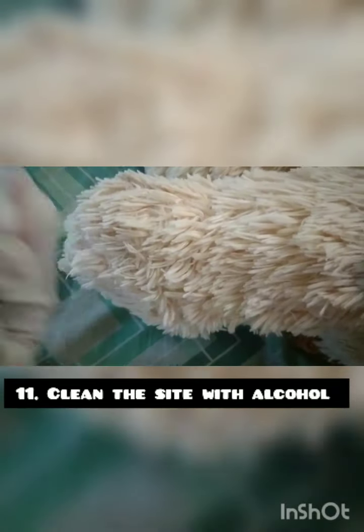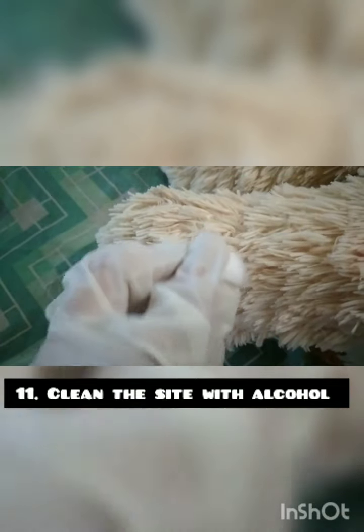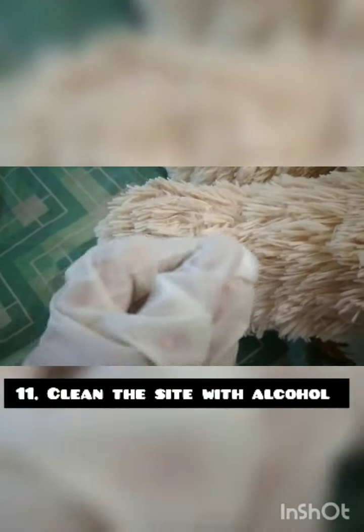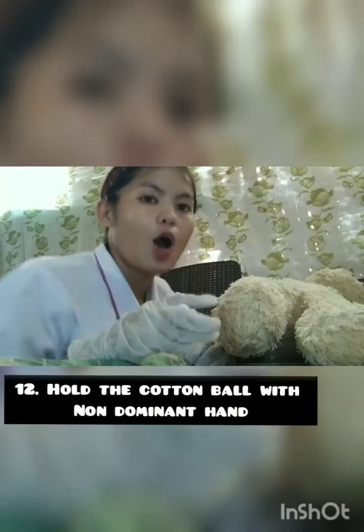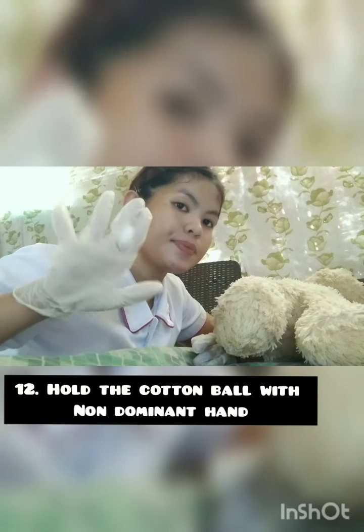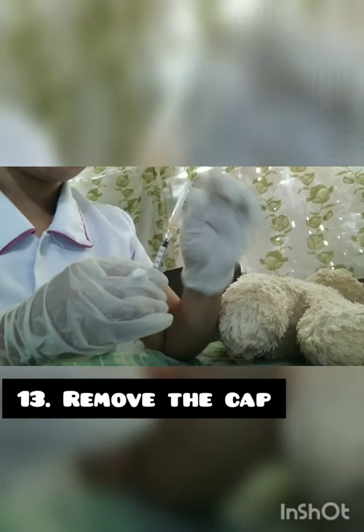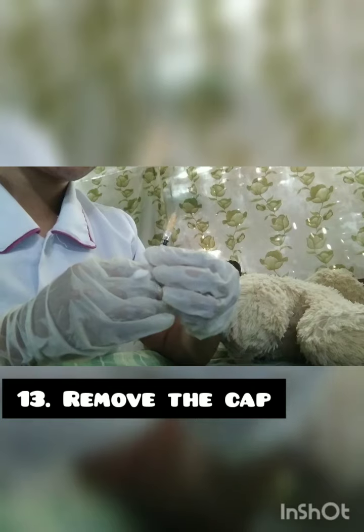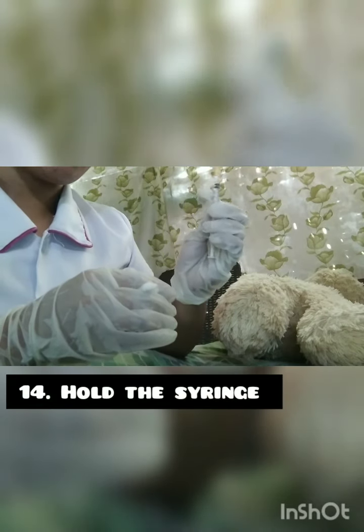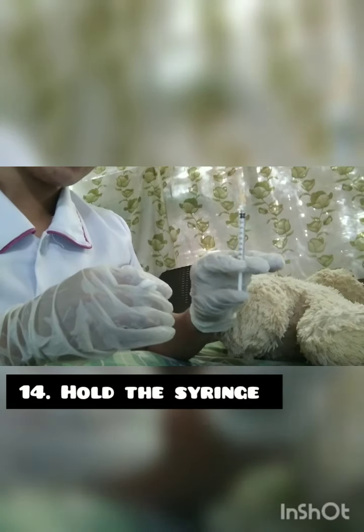Clean the site with cotton balls with alcohol in a circular direction for about 5 cm. Like this. Hold the cotton balls between the 3rd and 4th finger, like this. Uncap the needle. And hold the syringe between thumb and forefinger of the dominant hand and hold it as a dart with palm down, like this.